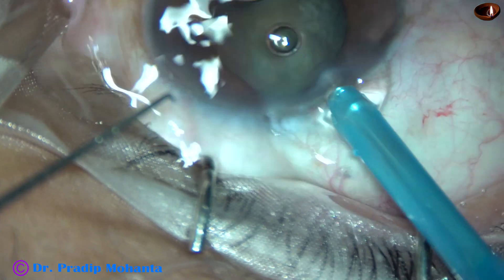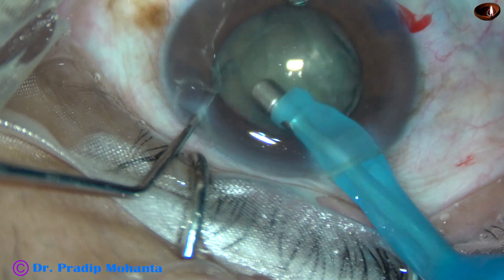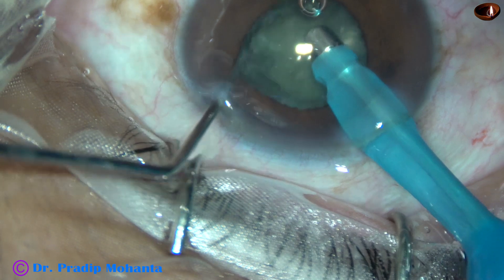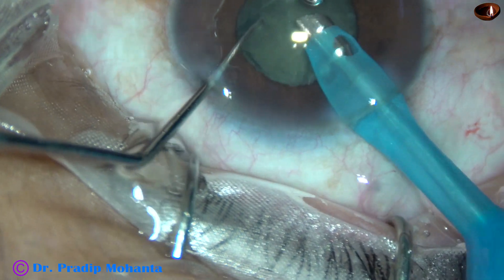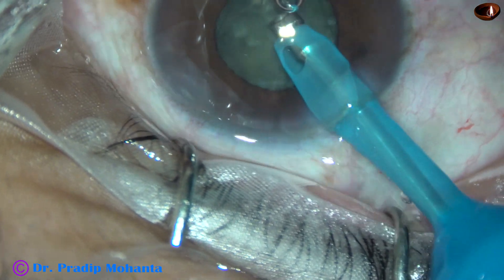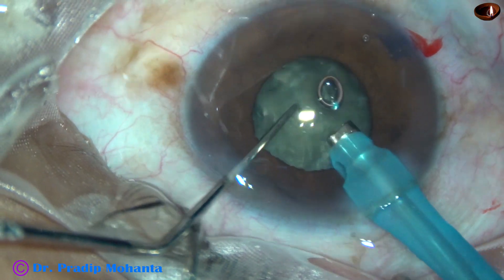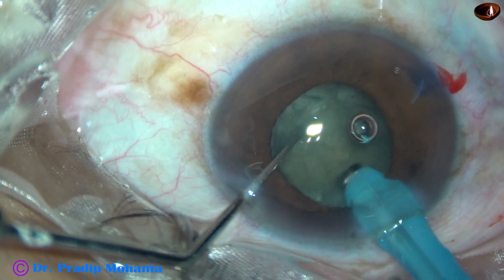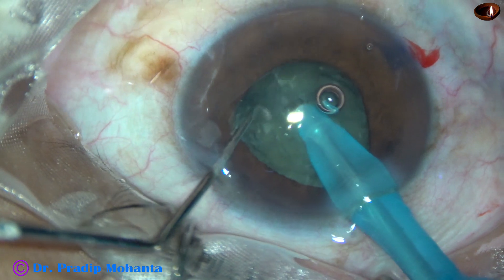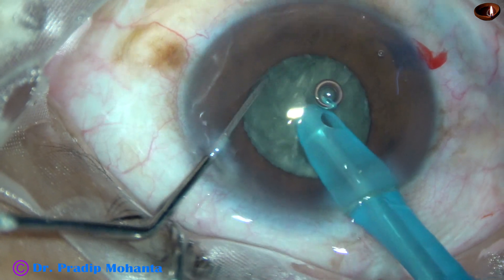Now see what happens as I start chopping the nucleus. As I aspirate some cortex from the anterior part, the pupil has become very small. The size of the pupil is about 4 mm or even 3.5 mm. And now, as I try to hold and chop the nucleus, the size becomes about 3.5 mm.